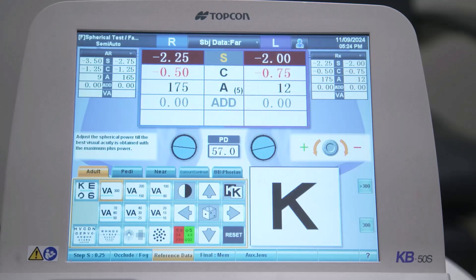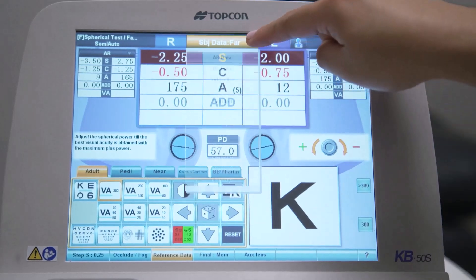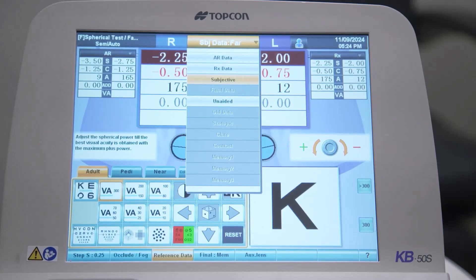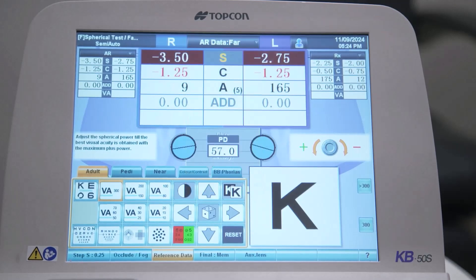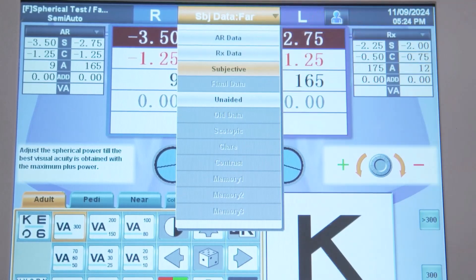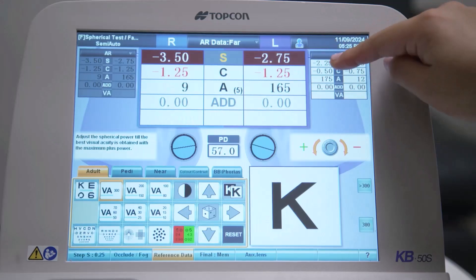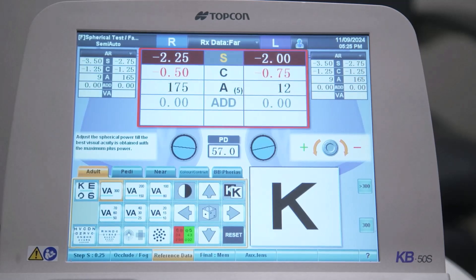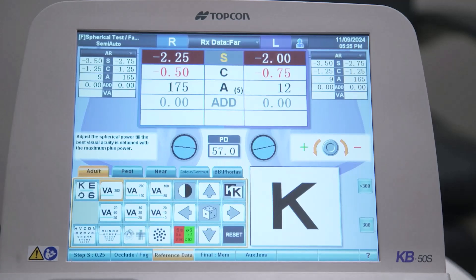Imported or manually entered reference data are displayed on either side of the main data. The reference data you are most likely to use is the objective data measured by the autorefractor and the glasses data measured by the lens meter. Touching one or other of these reference data sets swaps them into the main data area, resulting in the reference data being loaded into the 4Optorhead.